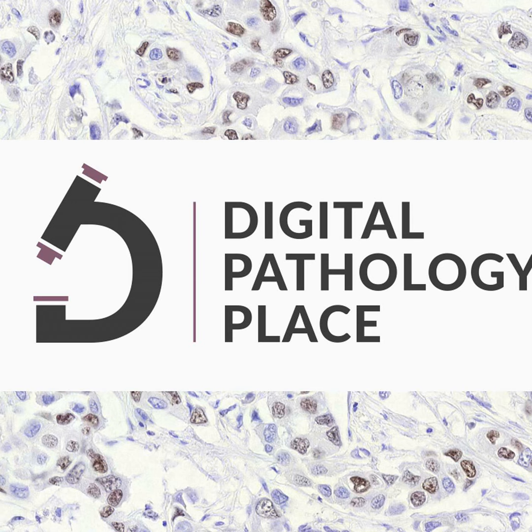When validating a digital pathology system, the intended use should be defined, which could range from generating illustrative images, conducting pathology consultations, facilitating telepathology, assisting diagnosis, to performing primary histopathological evaluation. Depending on the intended use, the stringency or number of features to check and validate will vary. The process of validation is a collaborative effort involving pathologists, IT, quality assurance, and system owners. Representatives from each of these teams should participate in the validation process.